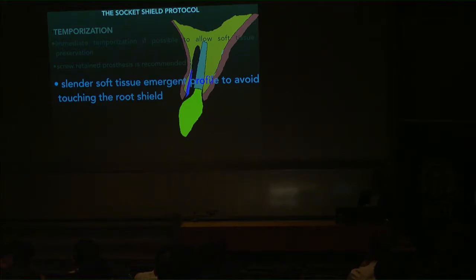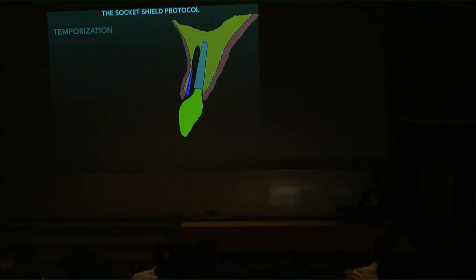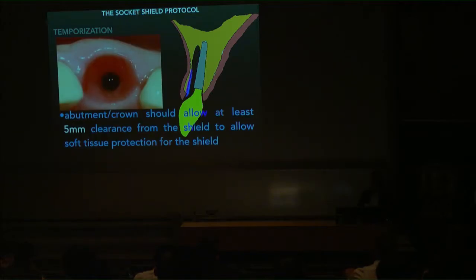As I mentioned previously, direct contact between the shield and the implant, the abutment or the crown should be avoided. And the shield should not be exposed after the soft tissue has completed healing.